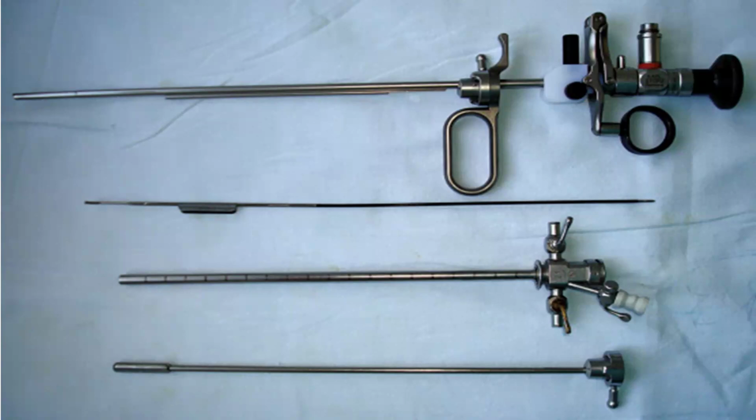If your OT boy puts the plate under the shoulder, will you be okay? You're getting ready for TURP, they're giving position. Now the OT boys put the plate under the shoulder of the patient. ठीक है कि बुरा है? No, sir. Where you will put it? Sir, it has to be underneath the thigh, sir. Why? Sir, heart rhythm changes, sir. So closest exit from the body, no? Yes, sir. So now you know where the monopolar current is going out from.